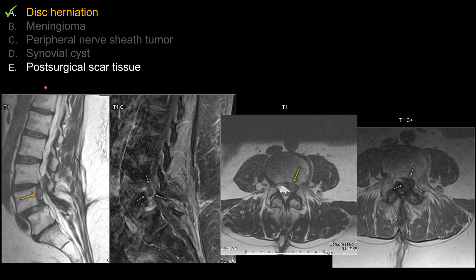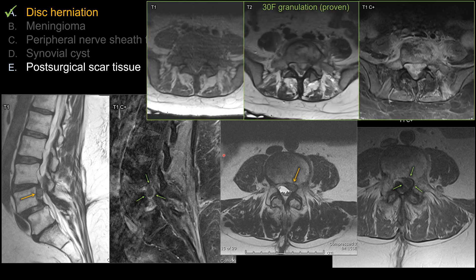For choice E, post-surgical scar tissue: the distinction between scar tissue versus recurrent disc is quite important after surgery. It's very difficult sometimes to tell them apart, especially if the scar tissue is formed in the shape of a disc. The key is the way it enhances. Enhancing granulation tissue or scar tissue has a blood supply, so it tends to enhance avidly and homogeneously. The disc lacks central blood supply, so enhancement occurs by very slow diffusion — you should not see central enhancement for the disc on normal post-contrast sequences. This is one reason we elect to give contrast on post-surgical patients, even without concern for infection.